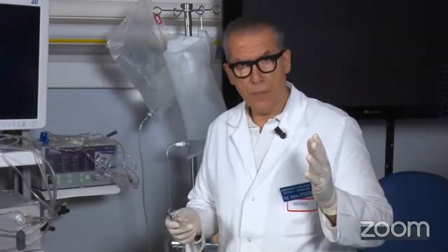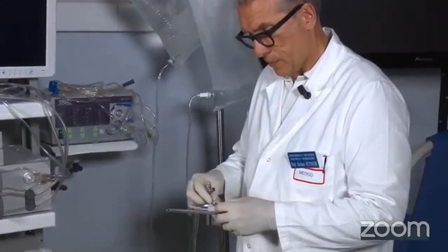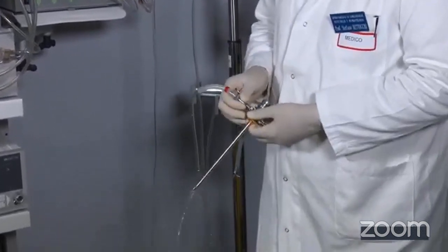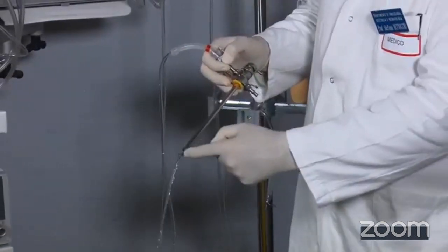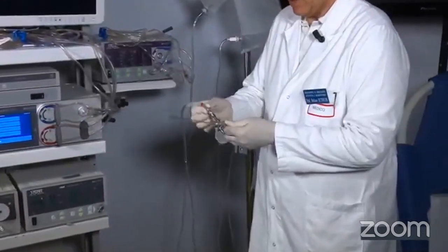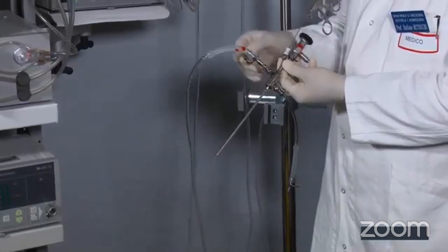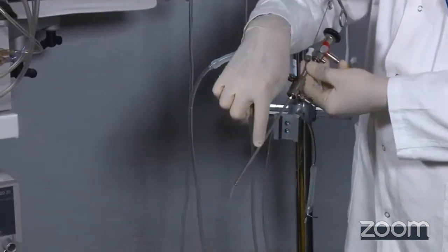So now, this is the theory, the methods. So if I take the resectoscope and I connect the resectoscope to the compressive cuff, you will see a certain flow generated because this is a much larger channel, so the liquid will find less resistance to pass through the instruments. But if I change the instruments and I take, remember, this is the syringe, and this is the syringe with the needle. I connect the system to my office hysteroscope. Look what's happened. I have a very delicate flow. Why? Because this is the needle on the syringe. The fluid found higher resistance inside the instruments, and therefore the flow decreased.